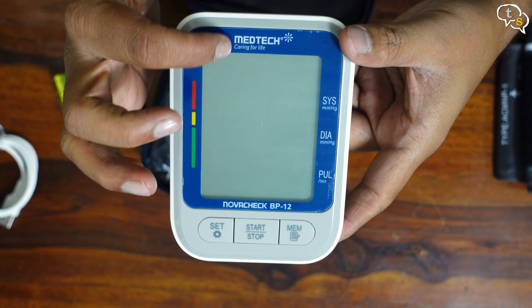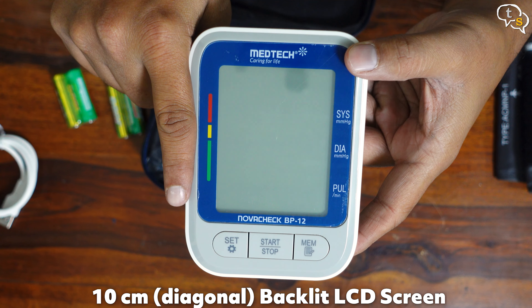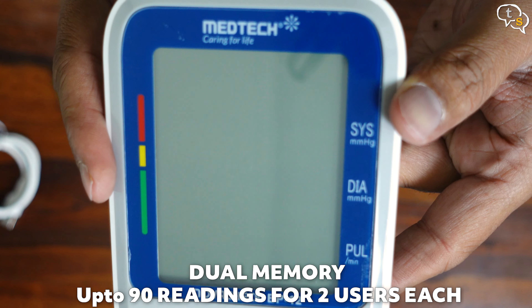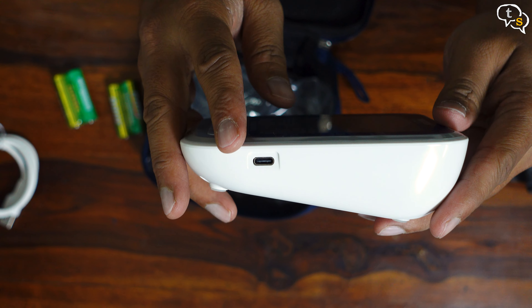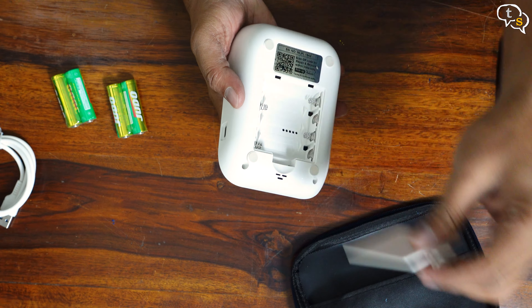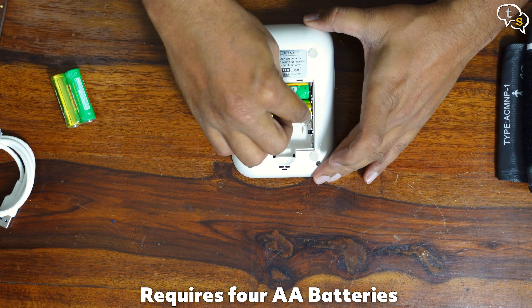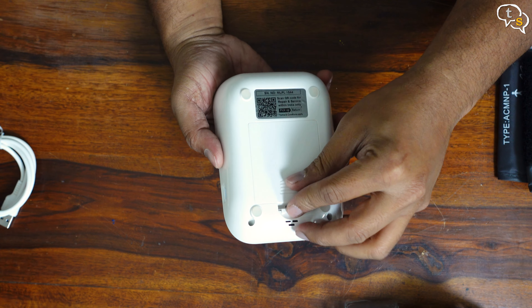Here's the BP machine itself — Medtech's Novacek BP-12, with a large LCD screen which is also supposed to be backlit. There are a couple of buttons on the face: set, start/stop, and mem, so that should be mostly memory. Here's the USB-C port on the side. We have the battery bay at the back — opening it up, we can load up the batteries in here. Nice that they are provided in the box. Battery 1, 2, 3 and 4. Close up the back and there we go — the display is active.